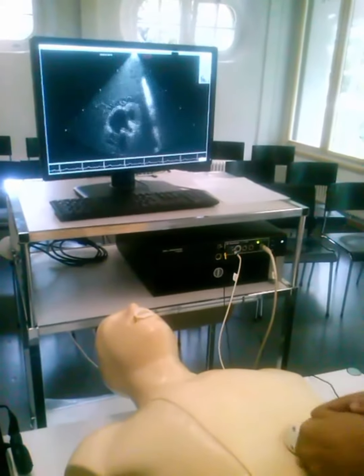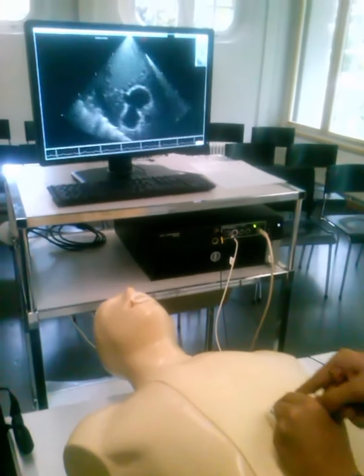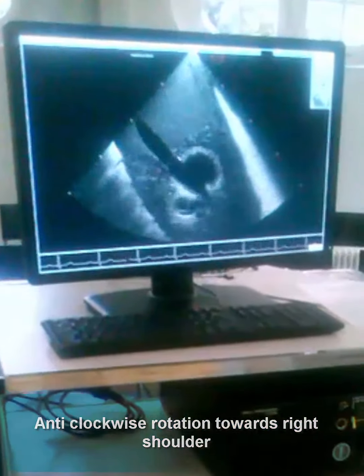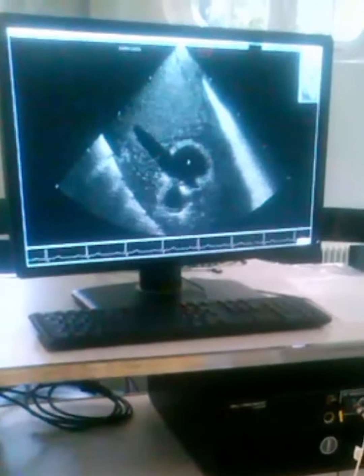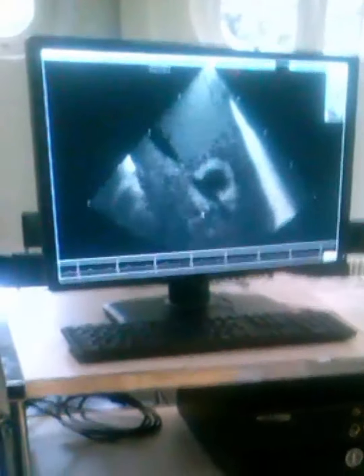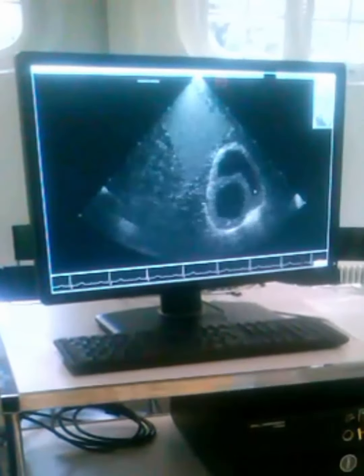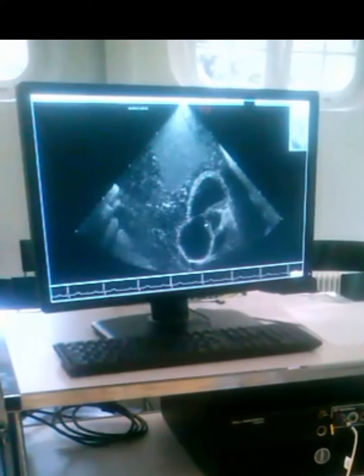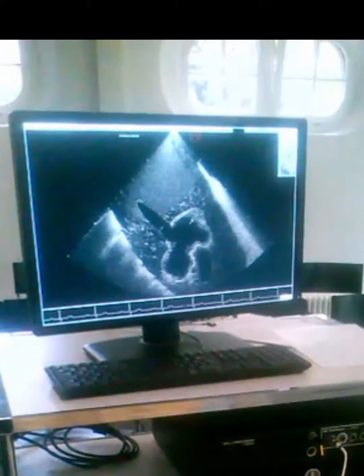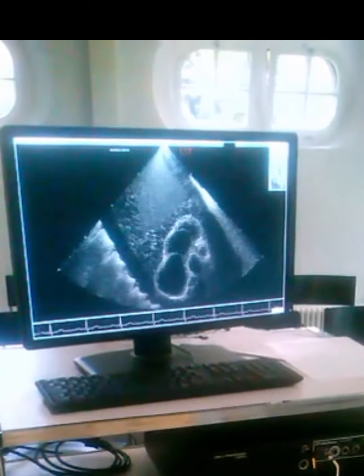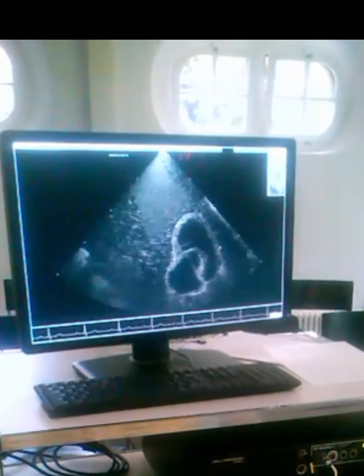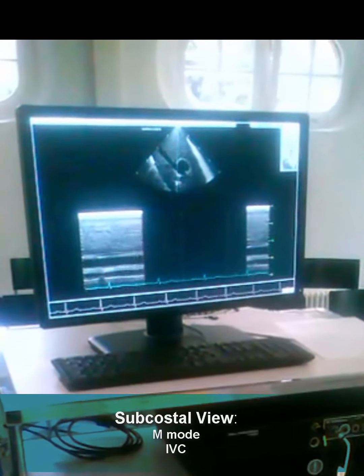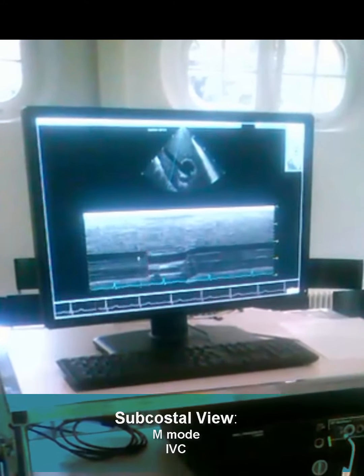And if you rotate it like this, you will take the short axis view. Now you can see the inferior vena cava (IVC) and the right atrium. You can check: this is the left ventricle, right ventricle, the aorta, right atrium, and right ventricle. You can take M-mode here to check the inferior vena cava.